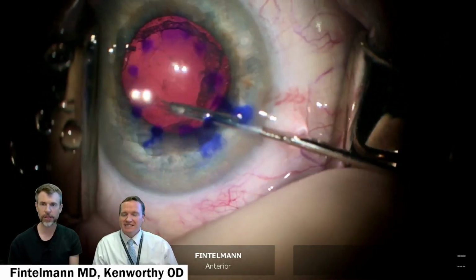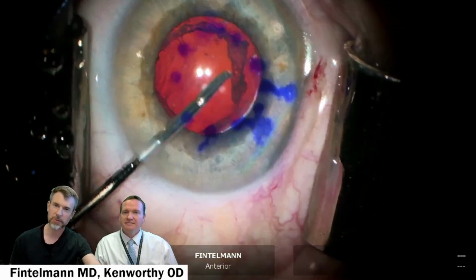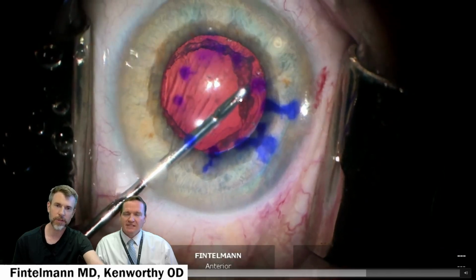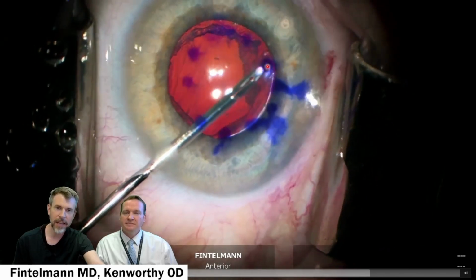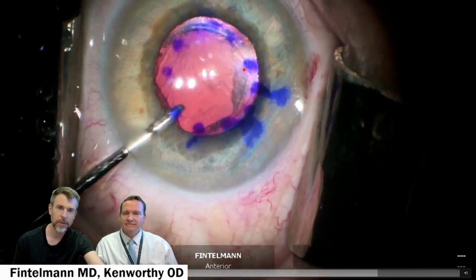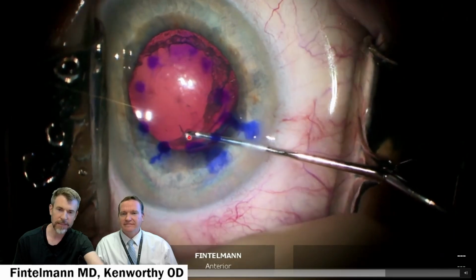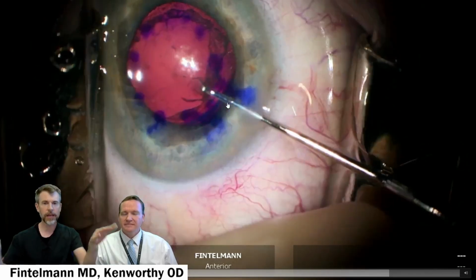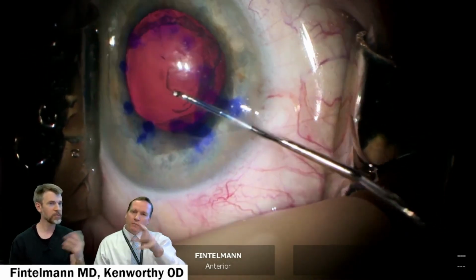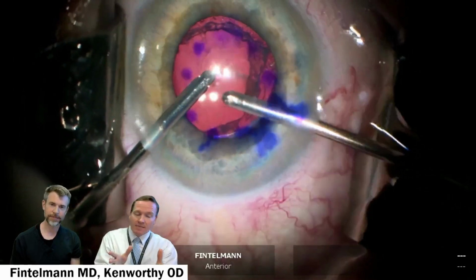I would never do this in a large one, because then the recovery time would be too long, and also the outcomes wouldn't be as good. This recovery time is usually within a month, and the improvement of vision and clarity is about 3 months. And this little forceps is just used to remove any little tags that might be still left on the endothelium. So as you can see, it's not perfectly round, but more of a cloverleaf appearance almost. And I want to show you have nice clean edges that then allow the endothelium to go over very easily. Is a scalloped edge a fair word for that? Yes. I kind of like thinking about that kind of scalloped edge around. That's what we see.